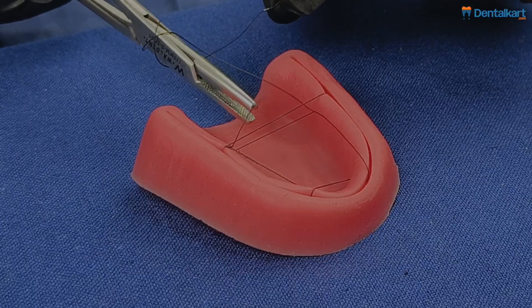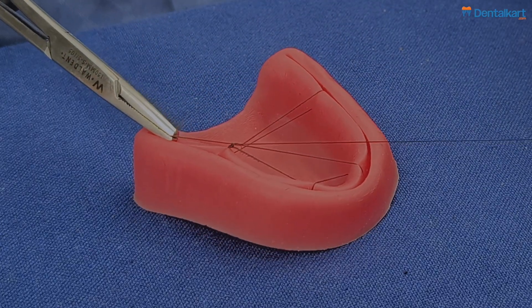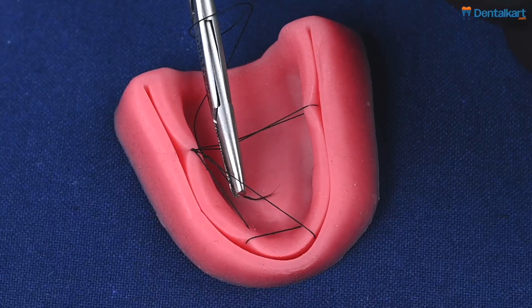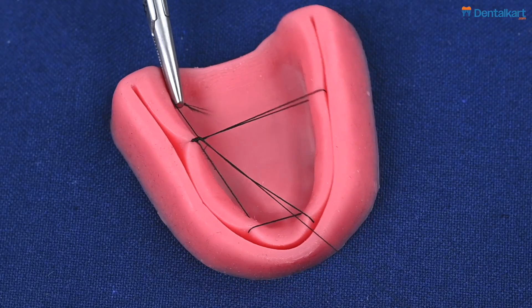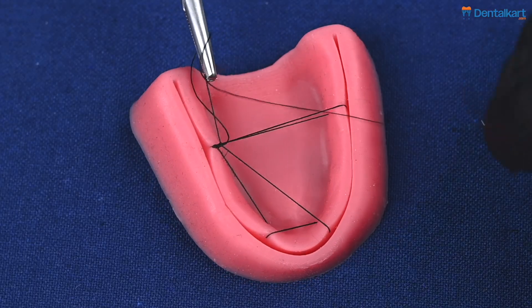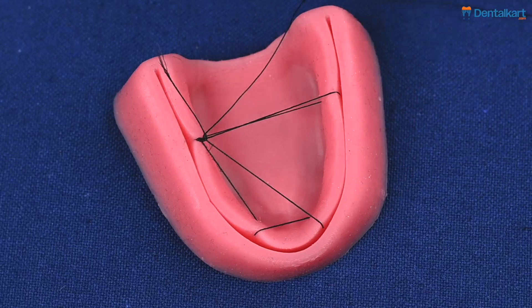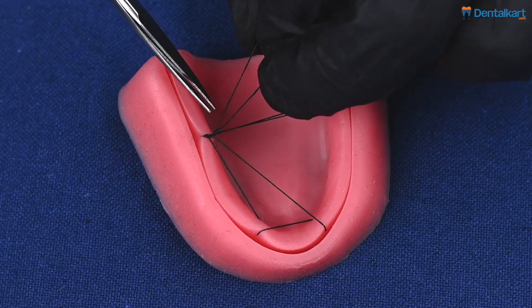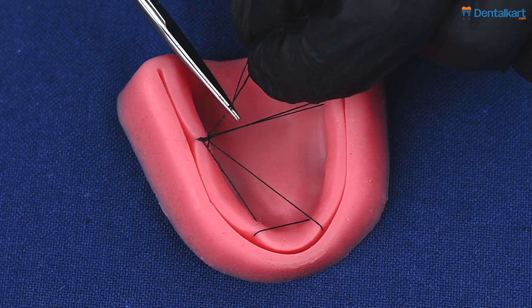The typical advantages of the palatal tie-back suture are visibility and access. When you're doing a full mouth case for implants, this is greatly helpful because it will allow you maximum access and visibility without having the need to hold a retractor.